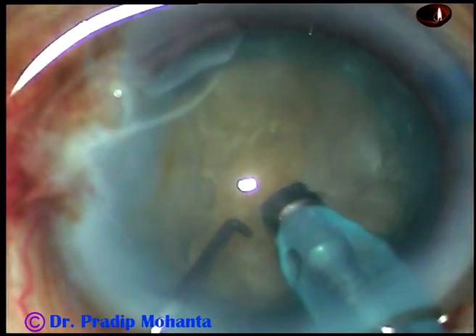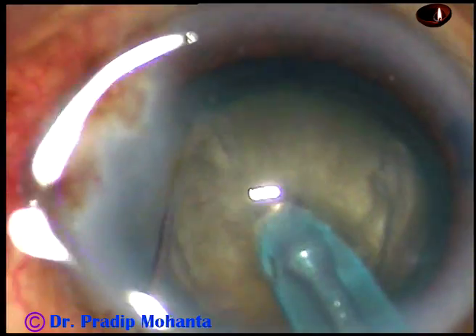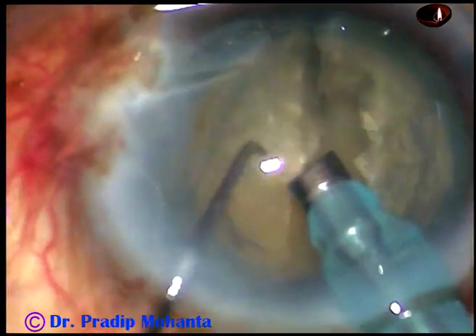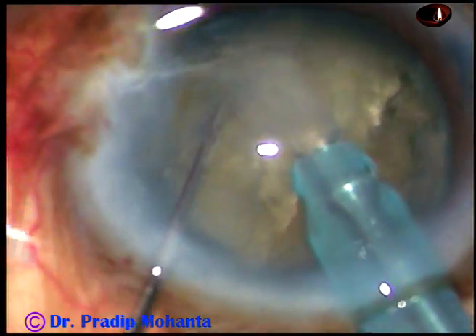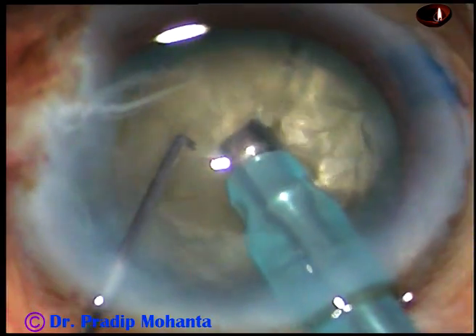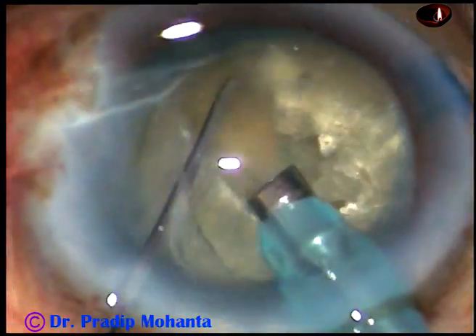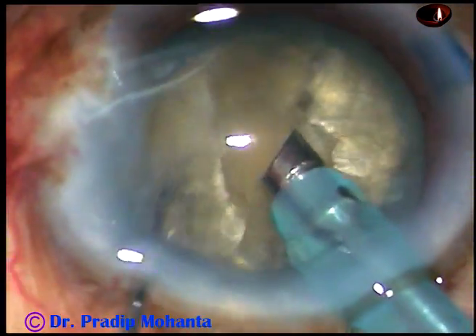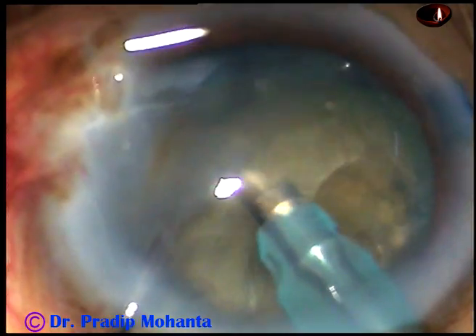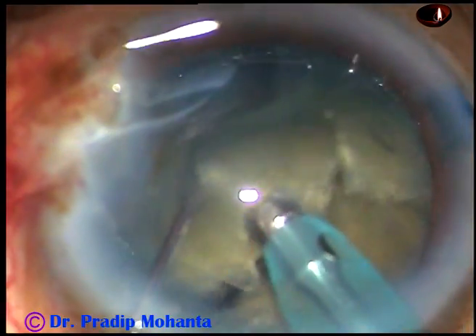It must be grade 4 or grade 4 plus. And now this is the first chop. Though the cataract appeared hard, it is brittle and it is getting divided very easily. So it is not a very hard cataract — it is about grade 4 or even grade 3 plus nuclear sclerosis.